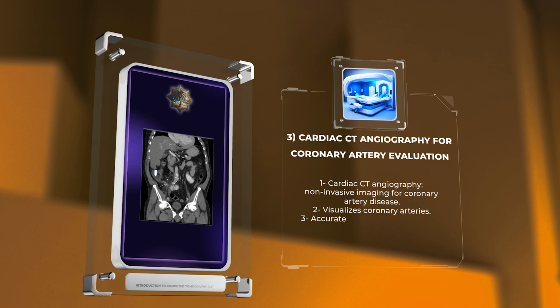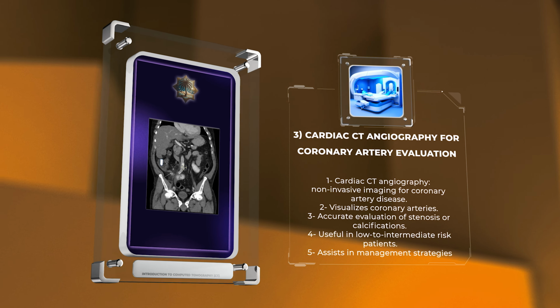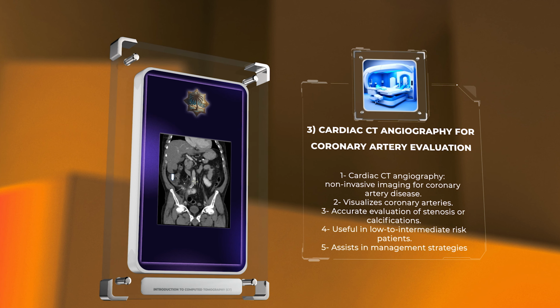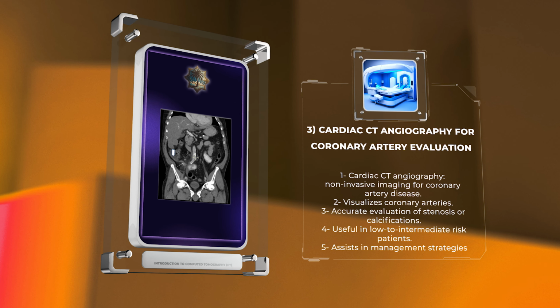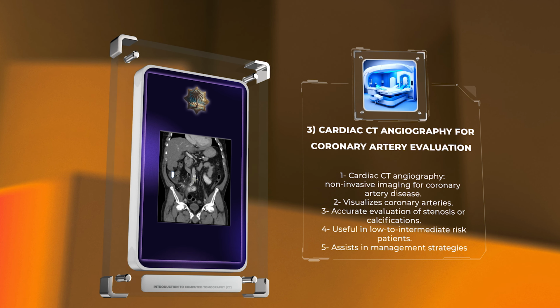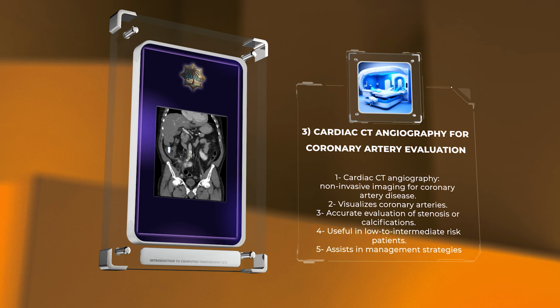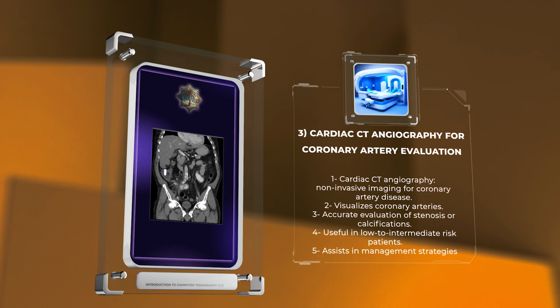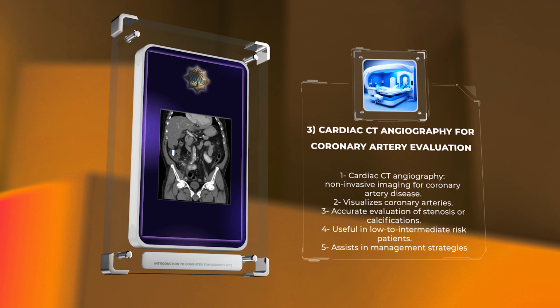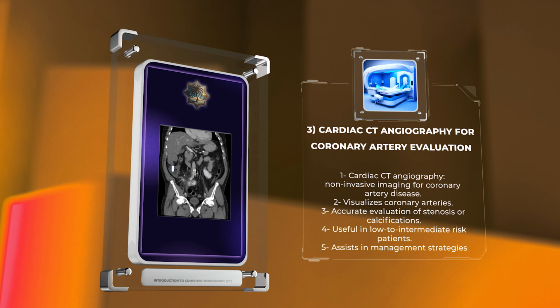Cardiac CT angiography has emerged as a non-invasive imaging modality for assessing coronary artery disease. By utilizing specialized techniques such as prospective gating and high spatial resolution imaging, cardiac CT angiography can visualize the coronary arteries and accurately evaluate the presence of significant stenosis or calcifications. This technique is particularly useful in patients with low to intermediate risk for coronary artery disease and can assist in the selection of appropriate management strategies.